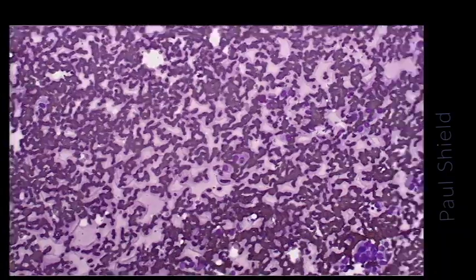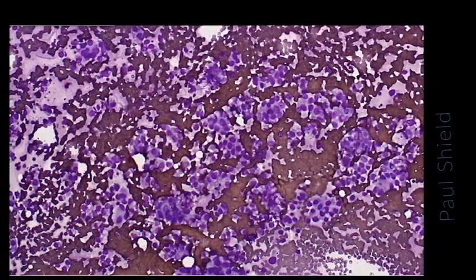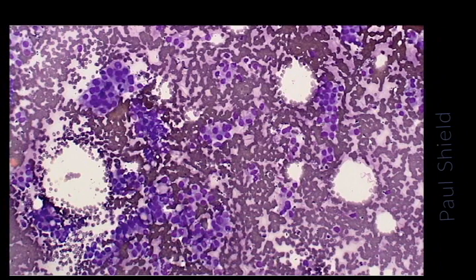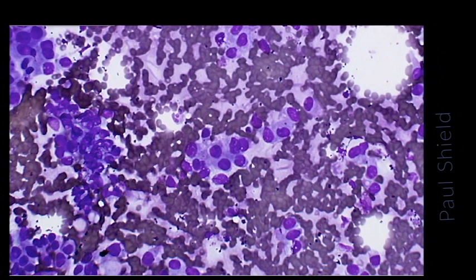If we look around the slide a bit more, you can see that actually there's quite a lot of those, and they're cells that are arranged mostly in cohesive groups, little balls of cells if you like. You can see there's quite a lot of them. They have a bit of three-dimensionality to them. And the cells present in those have a fair amount of cytoplasm, so you can see there's some quite large groupings of cells all around the place. Just looking at them under high power, you can see they have a moderate amount of cytoplasm, mostly round to oval, fairly uniform sized nuclei.